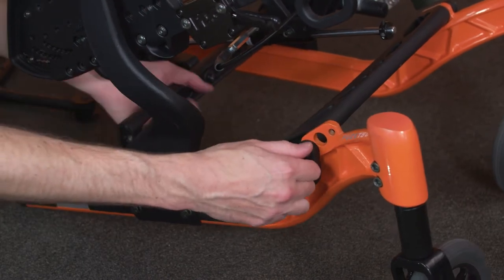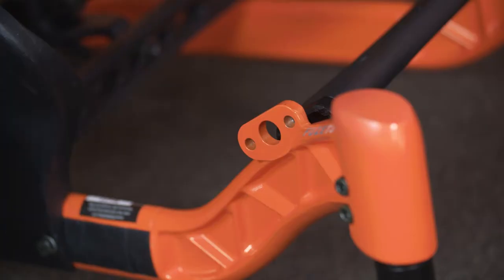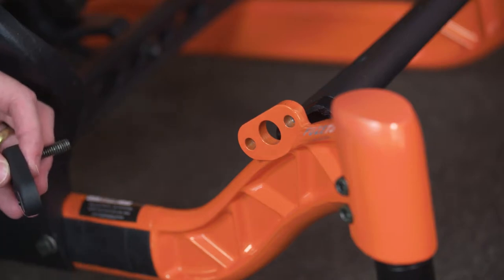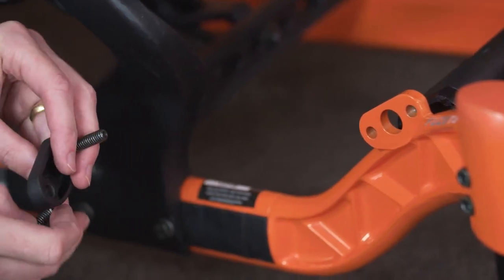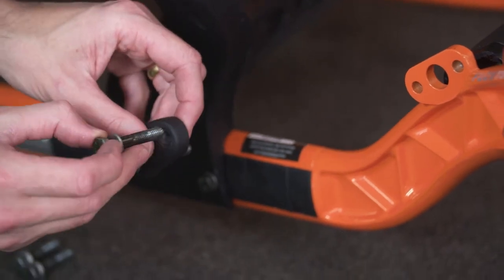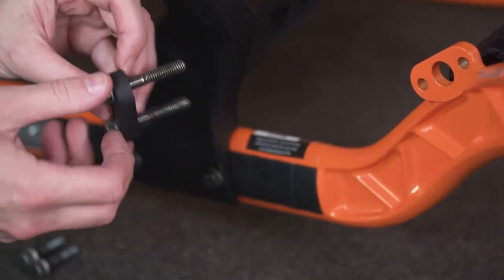When adjusting the width of the wheelchair, the adjustment should be completed in a symmetric manner on both sides. Remove the current crossbar mounting fasteners. If adding spacers, use longer replacement fasteners; if removing spacers, use shorter replacement fasteners. The replacement fastener should be one half inch longer for each spacer added, or one half inch shorter for each spacer removed.